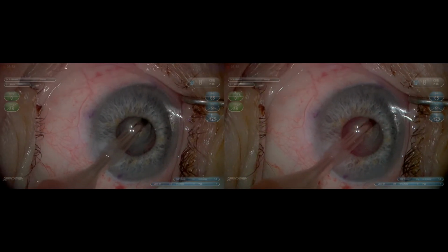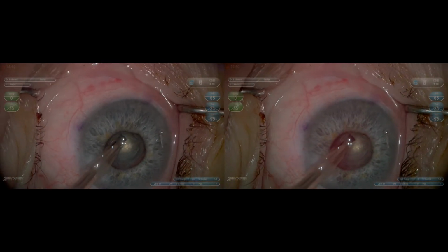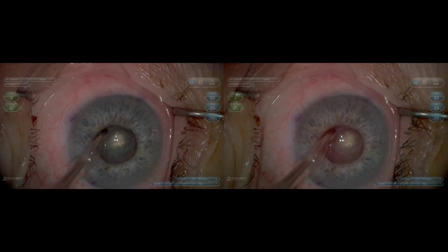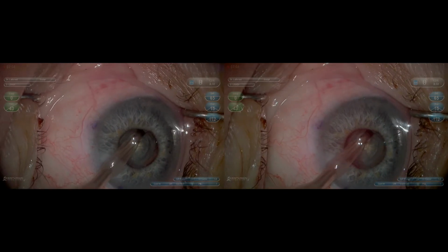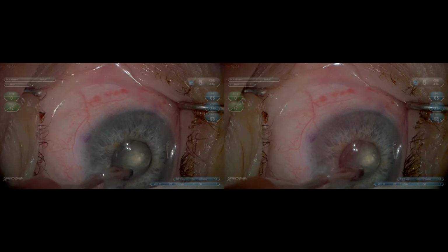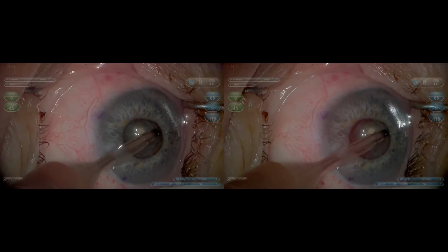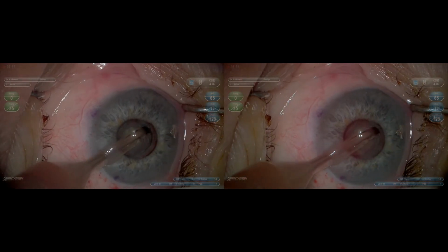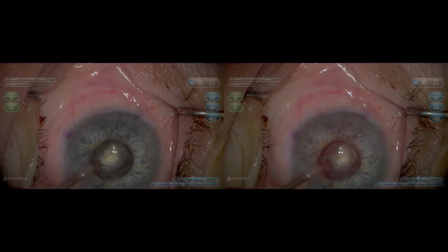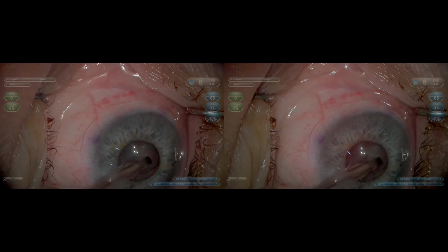With femtosecond technology, I adjust my technique where I bowl out the lens. I know I can continue to sculpt deeper as long as there's cuts in the lens. I still have a 500 micron cushion. I also have a chop pattern that extends to 5.3 millimeters, so I'll at the end be able to still crack this lens into 4 perfectly sized quadrants.